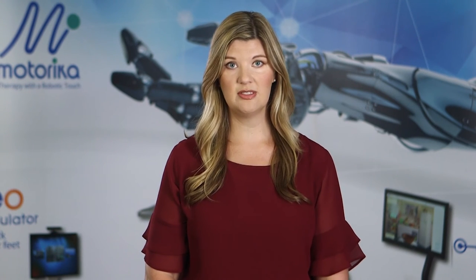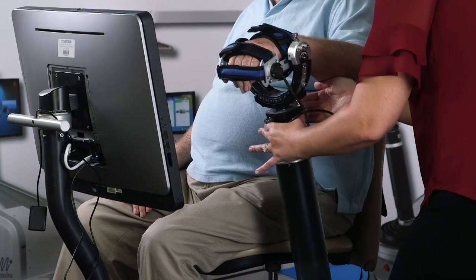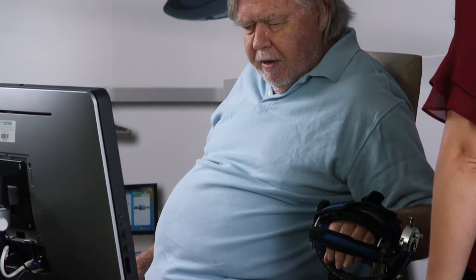Any patient with a neurological condition or even patients with orthopedic conditions can be appropriate for REOGO therapy. Because the REOGO can provide passive range of motion, various levels of active assist range of motion, or allow a patient to be completely active, many types of functional levels can benefit from the REOGO.